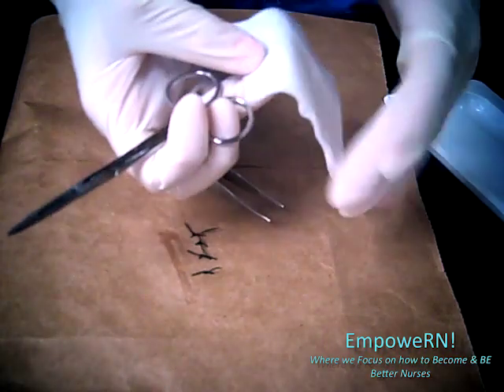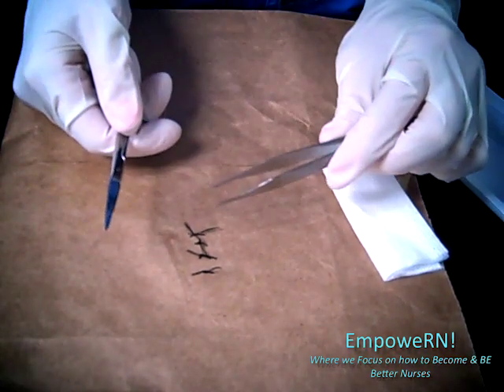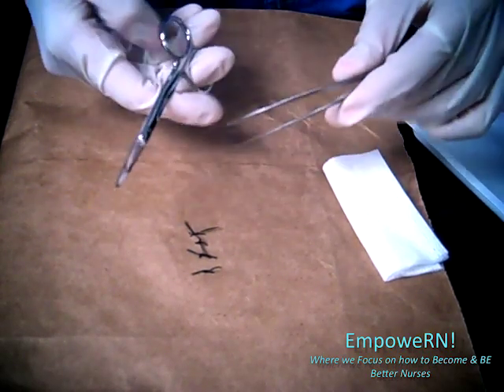First you're going to count — one, two, three, four. We have four sutures. If you want, you can wait until the end and count them at the end too.